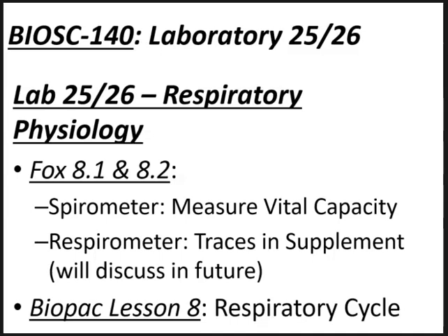So clinically, we give what's called pulmonary function tests. These tests are performed to evaluate lung function in patients. We use an instrument called a spirometer to obtain lung volumes and then ask a patient to blow in it for a certain amount of time. Based on the amount of air that the patient blows into the spirometer, we can get an idea of how well the patient's lungs are functioning.